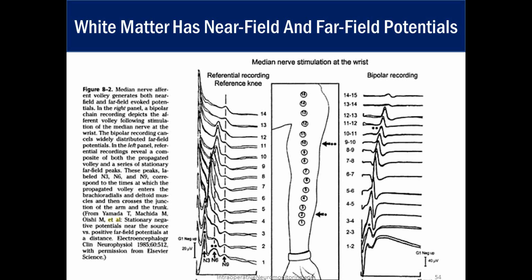Like I said, on the D-wave monitoring, we can reference one electrode to a distant referential electrode. Sometimes we can do it to Erb's point or some other additional electrode we place on purpose. And you can record a D-wave, and sometimes that's a good way of recording it, especially if the bipolar recordings aren't working. But you are more likely to pick up a bunch of noise in the area, especially in the cervical area.